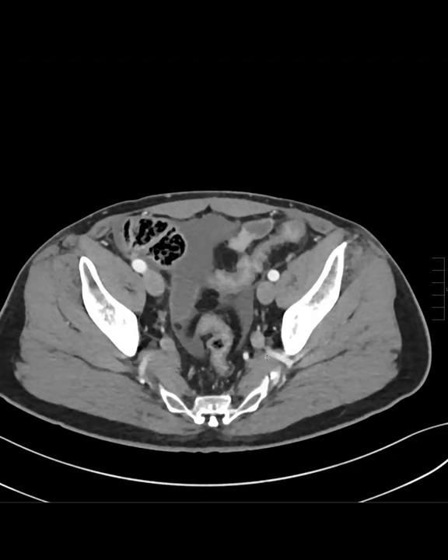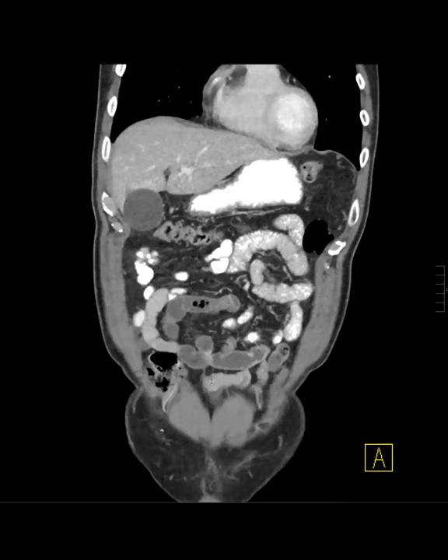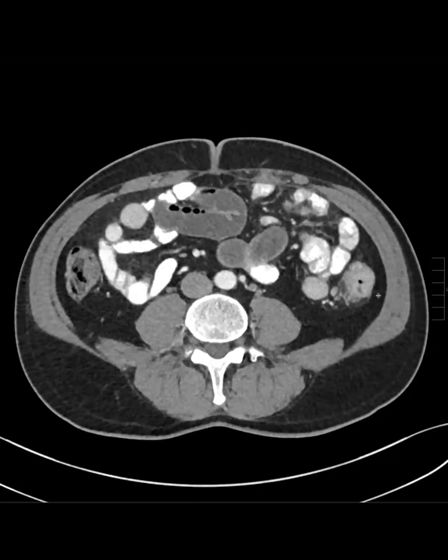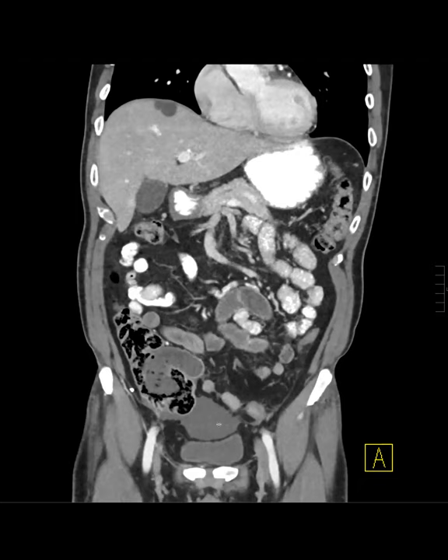I think we're supposed to find multiple diagnoses here. So we have some fluid. There was some peritoneal nodularity or stranding. There's a descending colon cancer and a mucocele coming off. Yes, right. So this patient has two different coexisting diagnoses. In the descending colon, there's colon cancer. And then there's a mucocele, as Cooky pointed out. Here it is, and it's ruptured. So now you have myxoid content in the abdominal cavity.